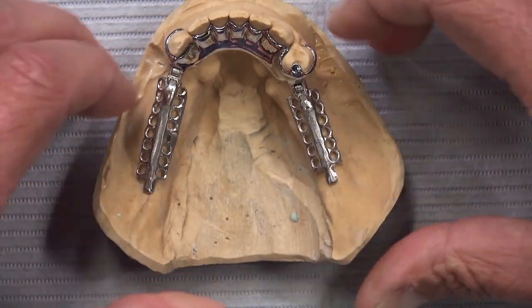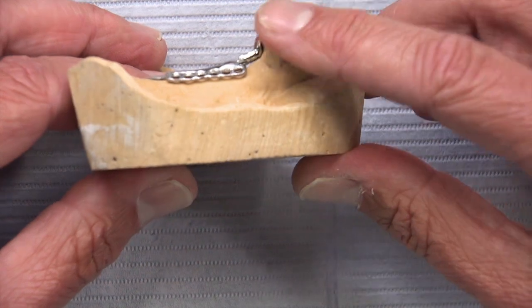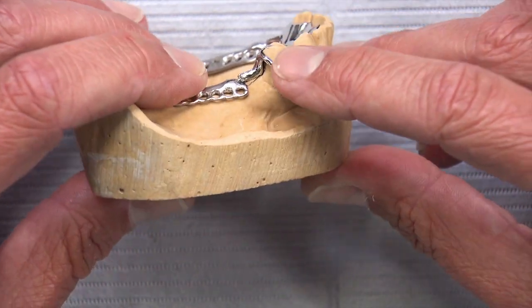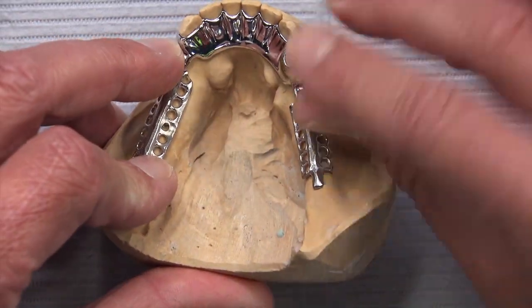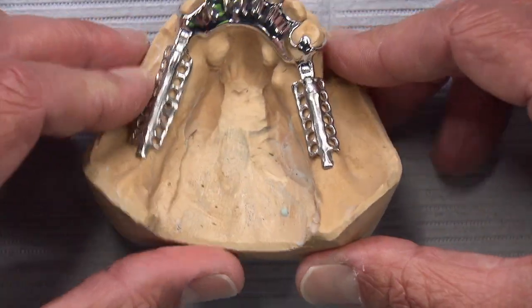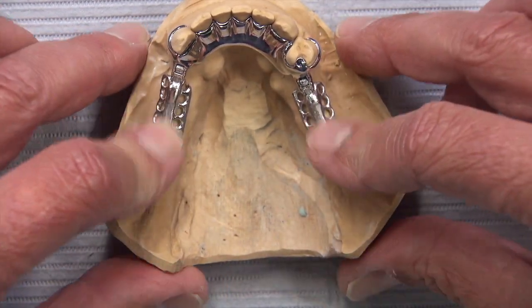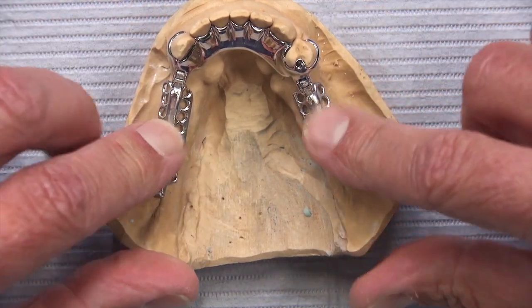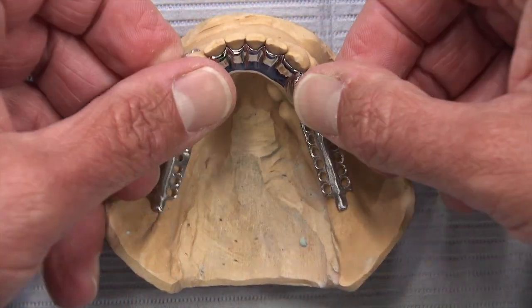That looseness as the ridge resorbs is one disadvantage, though the partial can of course be relined to the new tissue height. On this side, we really can't get below the infrabulgе, which is another good reason to use this hinge — because otherwise when the patient bites down, there's going to be a tendency to pop that clasp off the tooth, or at least raise it up, and we will lose retention.